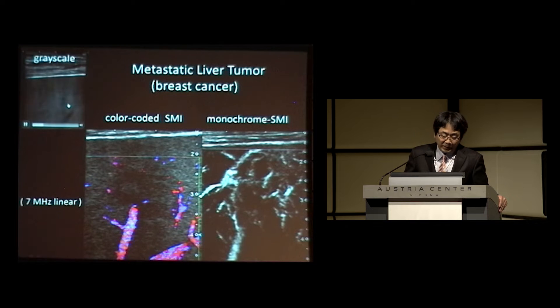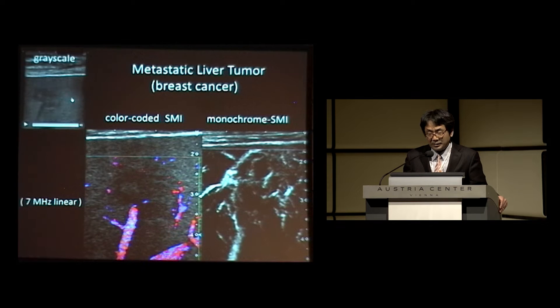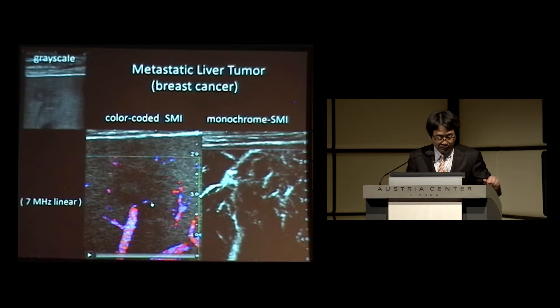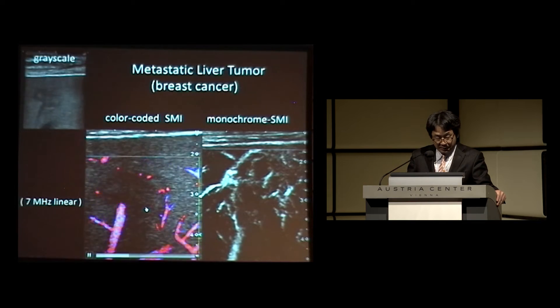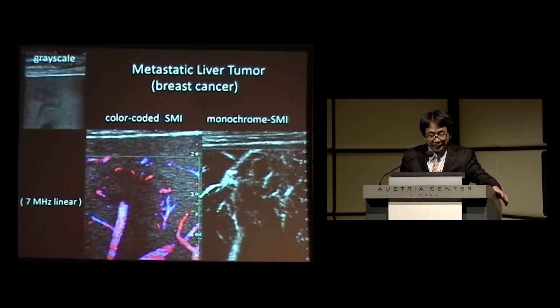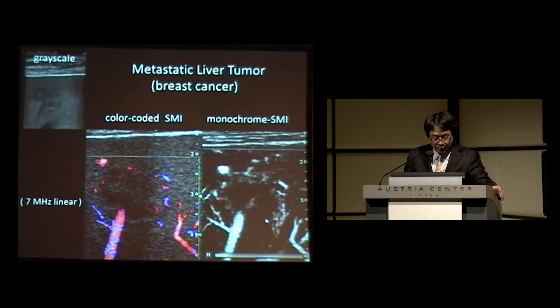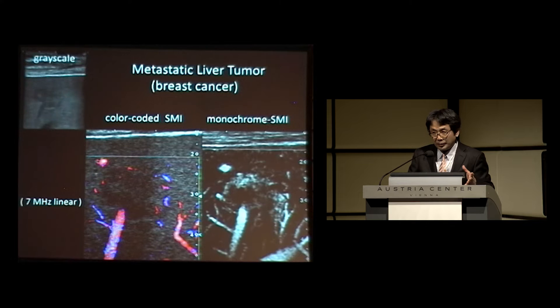This case is a metastatic liver tumor caused by breast cancer. On grayscale, you can notice a hypoechoic area that is suspicious, but you cannot be sure about the nature of this tumor. Using color-coded SMI, you can see many tumor vessels surrounding this hypoechoic area. And monochrome SMI shows more of the fine vessels, indicating this is a metastatic liver tumor.